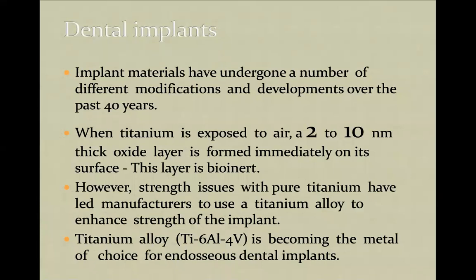Of course, the most expensive one nowadays is from the Straumann company, which will show a very high success rate of dental implantation. But an expensive implant means that the price for your surgery and your further prosthodontic rehabilitation will also increase.